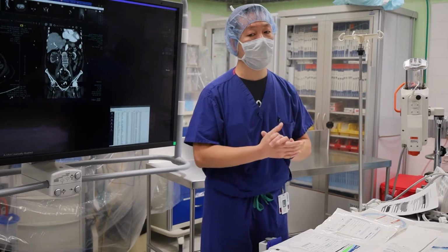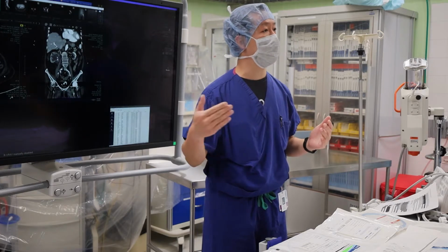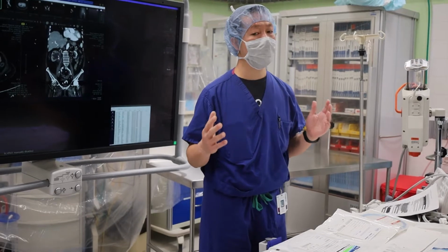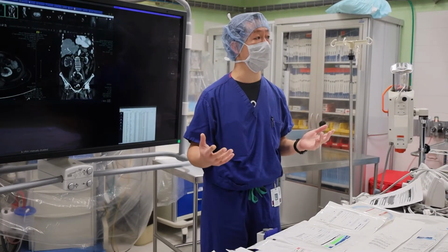And so because of that, we tend to be very careful as to, do we go between the ribs, do we go underneath the ribs and partially see it? We have to really think about how we position the patient and how we use the ultrasound to identify our landmarks before we go in.